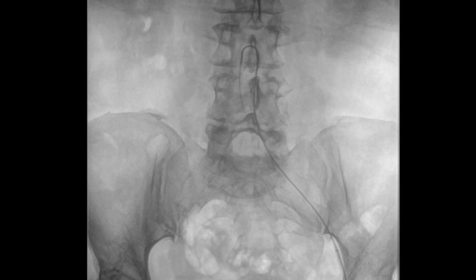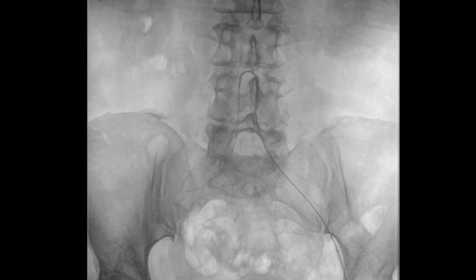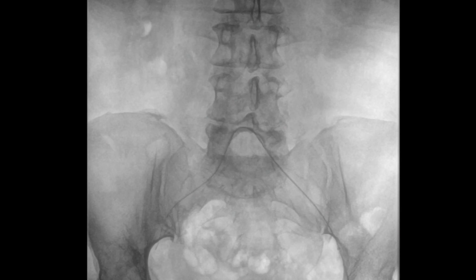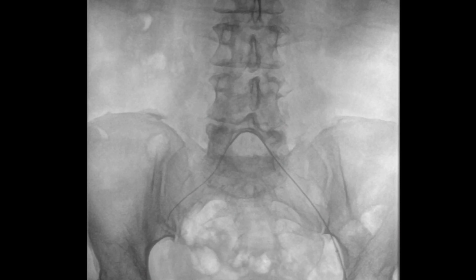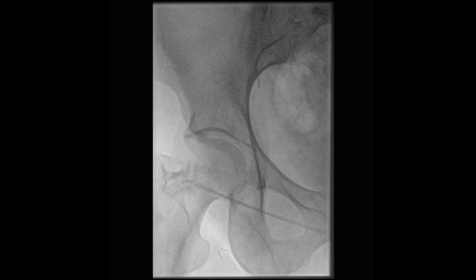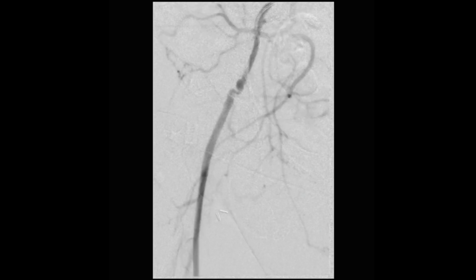A glide wire was then used to gain contralateral access as demonstrated in this video. The catheter was seated on the aortic bifurcation and advanced into the right common iliac artery. The wire was then removed and we performed a repeat angiogram to better delineate the anatomy.